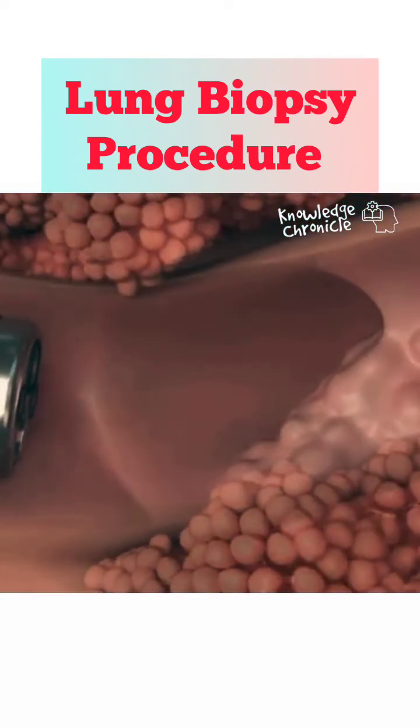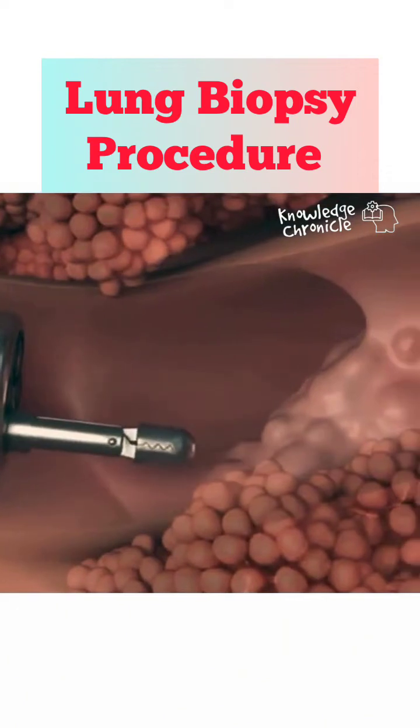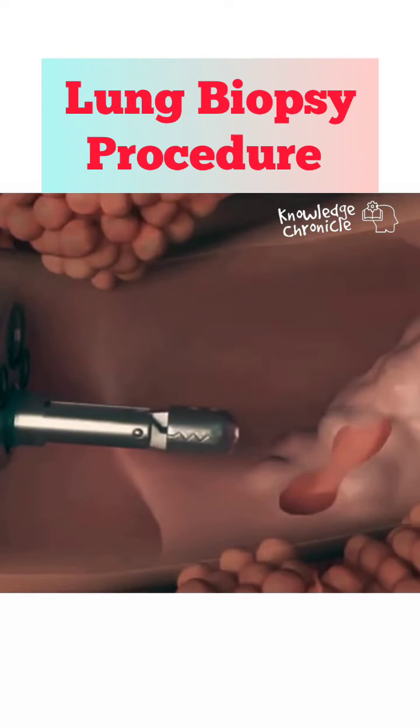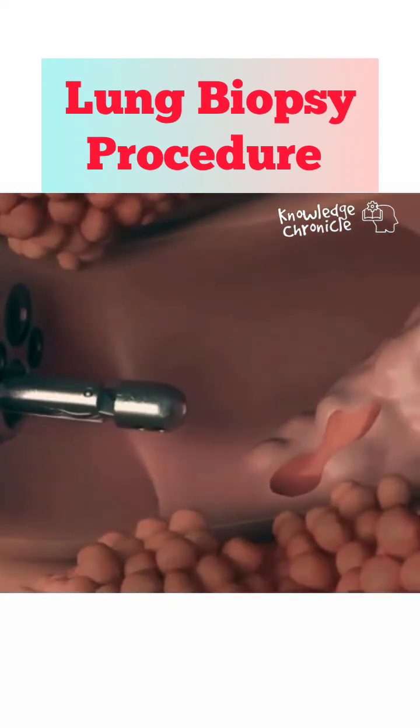Once the target area is identified, special instruments like forceps, a needle, or a brush are passed through the bronchoscope to collect a tissue sample. That sample is then sent to the lab for analysis.